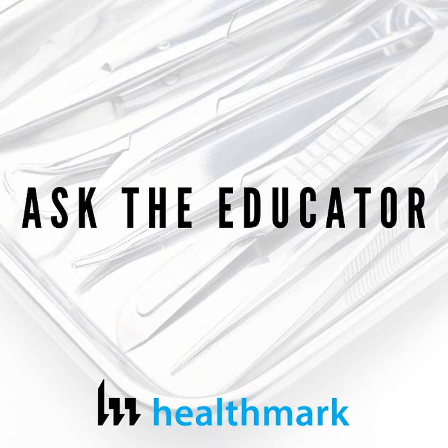It's not just enough to tell them, hey, this device is complex. Here's all the places you need to clean. They really need to understand why. And like you said, there's bone, there's tissue, there's a lot of things that are coming into those shavers that we're not used to seeing unless it's like an acetabular reamer or something like that.